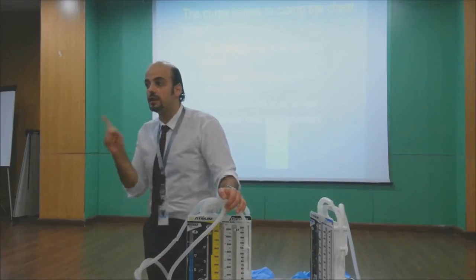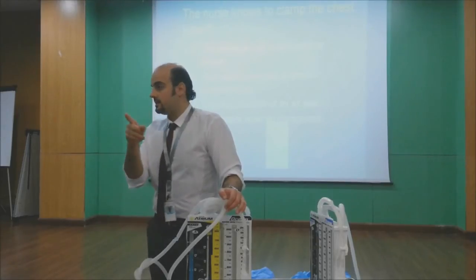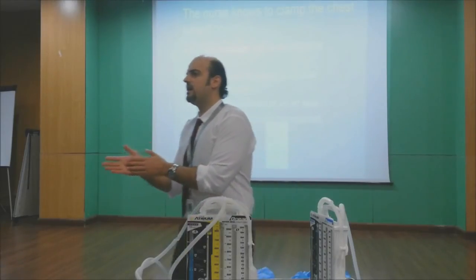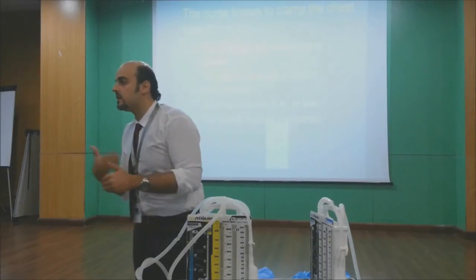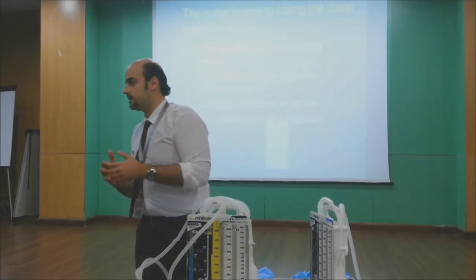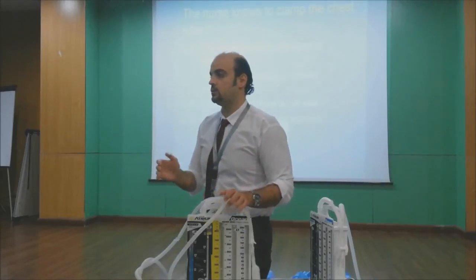And the patient is on a ventilator. Maybe to give negative pressure. Prophylaxis. Because I put a chest tube now in a critical patient. His coagulation profile is very bad. So the chance of recurrent pneumothorax or recurrent barotrauma is very high, critically high, 70%. So I just leave it there. It's not working, I know. It's not draining, I know. But I just leave it there as a prophylactic tube.